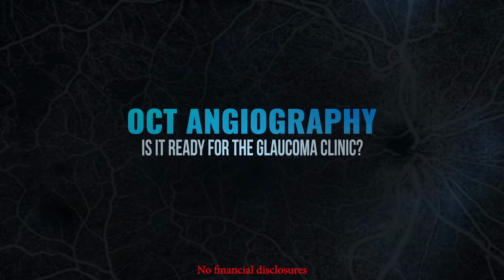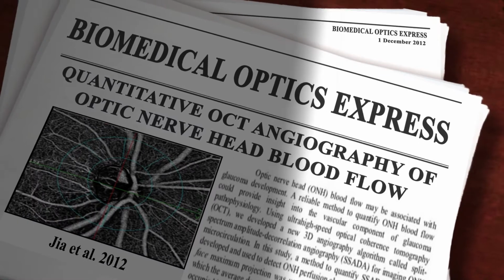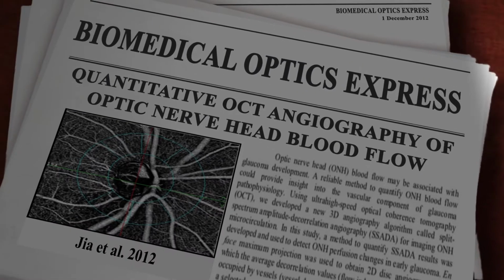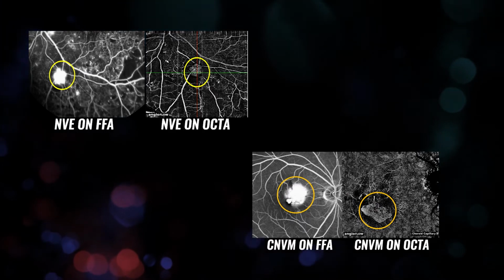OCT angiography. Is it ready for the glaucoma clinic? The technique of OCT angiography for studying optic nerve head perfusion was first described in 2012, prior to which its use was mainly explored in retinal pathologies.